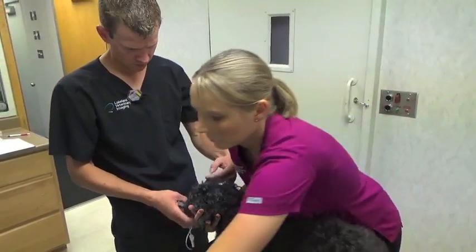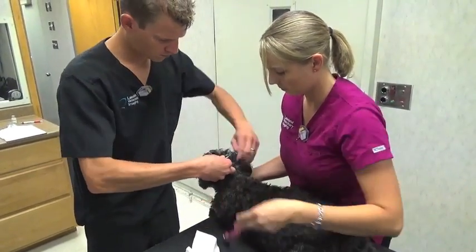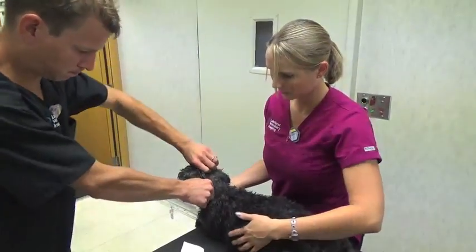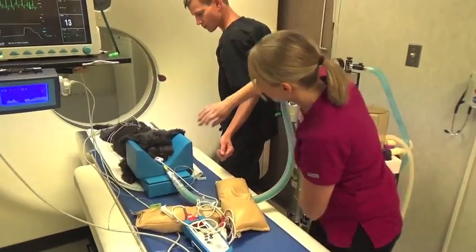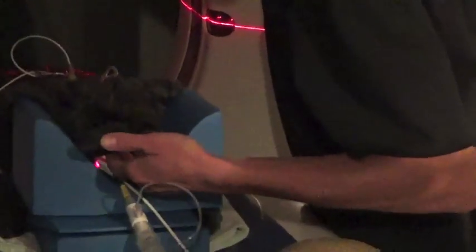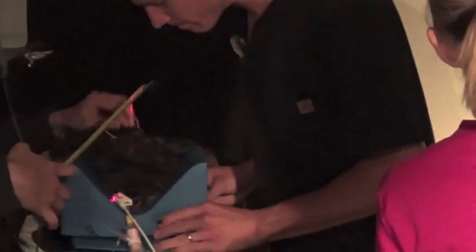This tube provides positive control of the airway throughout the study and allows delivery of inhalant anesthetic agent to maintain the desired level of anesthesia. The anesthetized patient is placed in the scanner bed where IV fluid support and multiple electronic monitoring sensors are placed. These sensors continuously monitor the cardiac rhythm, respiratory rate, arterial oxygen, and expired gas concentration of the patient. Our certified veterinary technicians also monitor manually to ensure the patient is at the desired plane of anesthesia during the procedure.